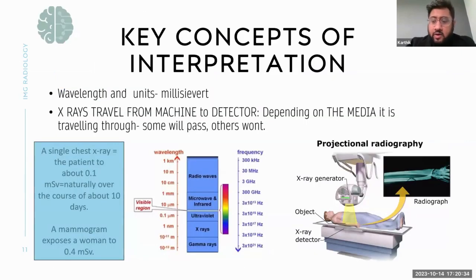During the next few weeks, we're going to be discussing the different levels of exposure of different X-rays and different modalities of imaging. A single chest X-ray shouldn't be that much exposure, but compare that to a lumbar spine X-ray, which is over 100 times the exposure. In an A&E setting, we don't normally do X-rays of the lumbar spine if we're suspecting a back injury, unless we're certain, because the level of exposure from a lumbar spine X-ray compared to a chest X-ray is huge. One of the things we've learned in A&E is about choosing when to actually X-ray your patient rather than just sending everyone through the machine.